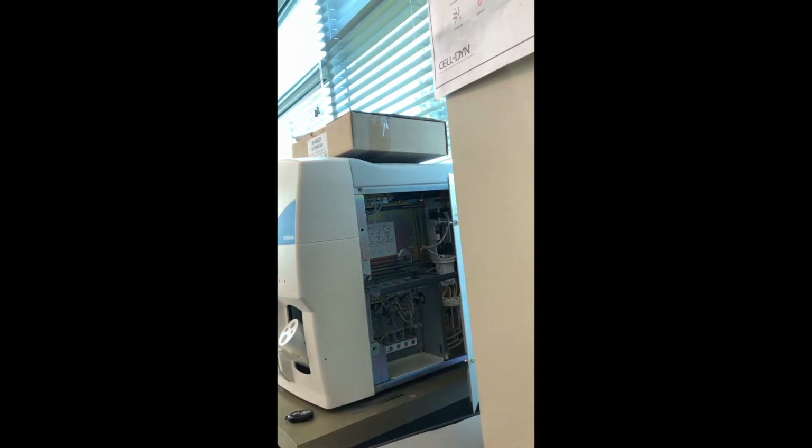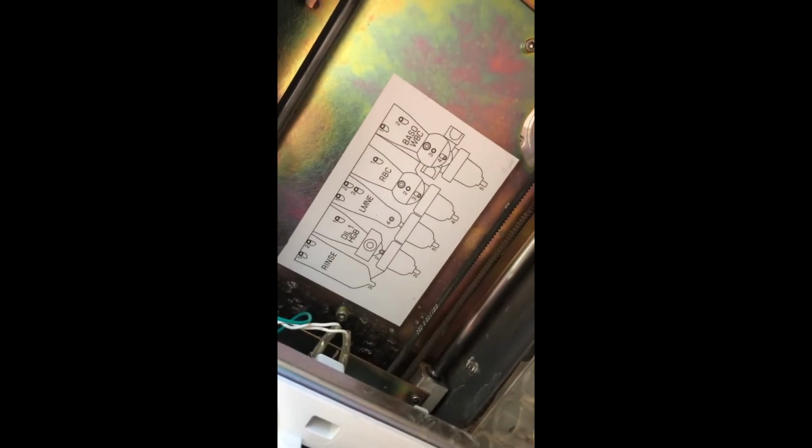And then we can see these chambers that they're talking about. So we want to pour 3 milliliters of Minoclair into each of these chambers right here, into these 5 chambers. And then right here you can see there's a key that says what these chambers are used for.